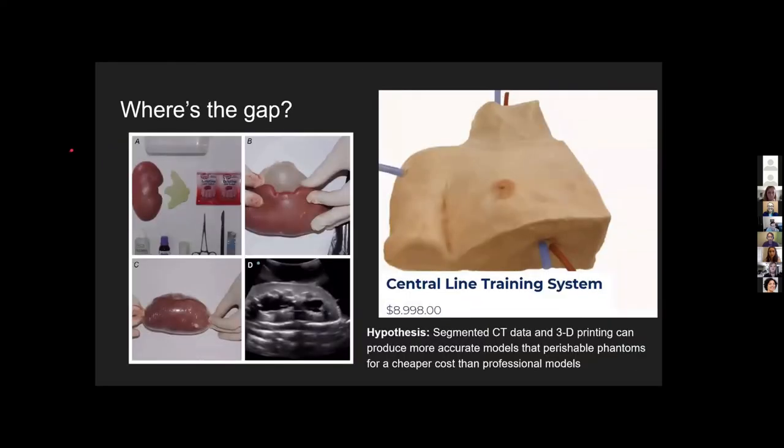Current resources are either ultrasound phantoms that fall in a range of really cheap perishable models, like a kidney made out of gelatin that doesn't last very long but can be made at home, or really expensive professionally done models like this central line training machine which teaches the exact same procedure but costs upwards of thousands of dollars. We believe we could make an ultrasound phantom that bridges this gap by using segmented CT data and 3D printing techniques.